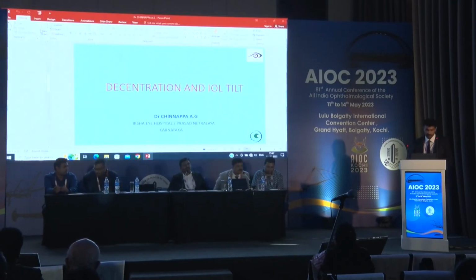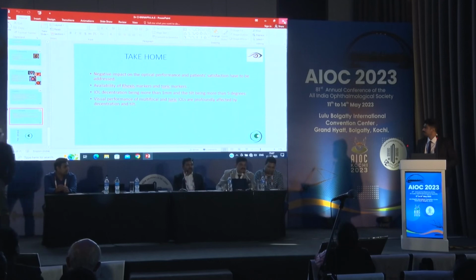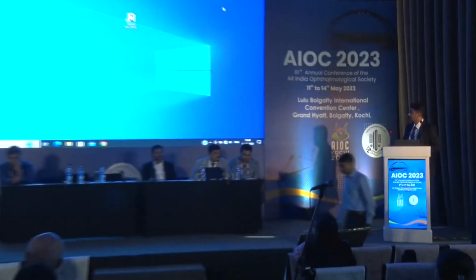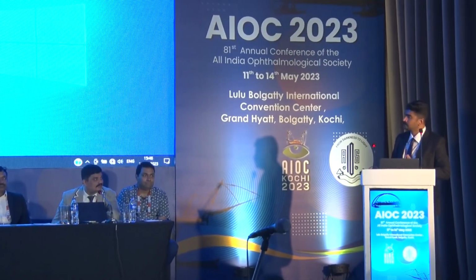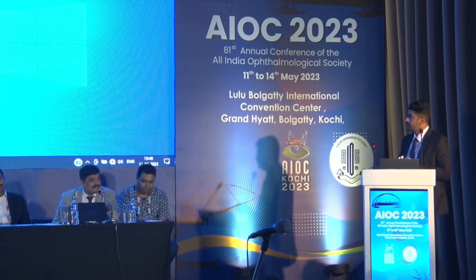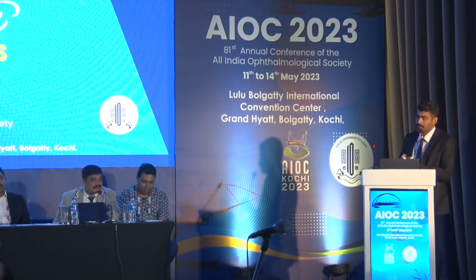Thank you, Dr. Chinnappa. I think the take-home message: if a patient is already having the tilt and or decentration, can we do it immediately or can we do it later on? Certain studies show that for some amount of patient glare and haloes, we give time for neural adaptation also. Certain patients just get adjusted with that, because the second surgery is always a second surgery. So can we give them the option of neural adaptation, or go straight away after a couple of weeks of surgery?